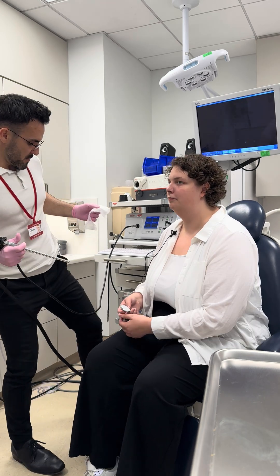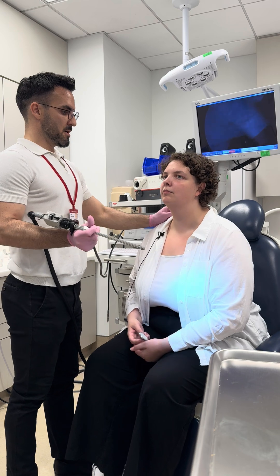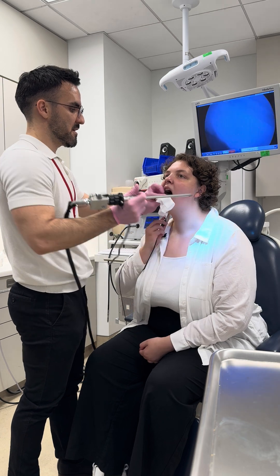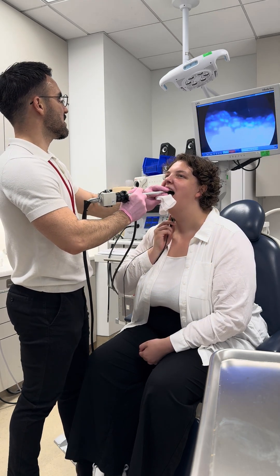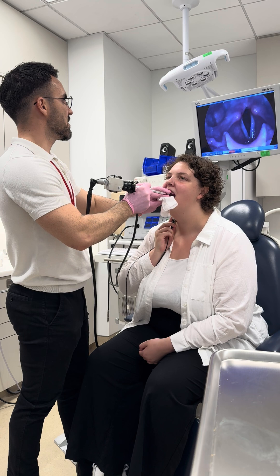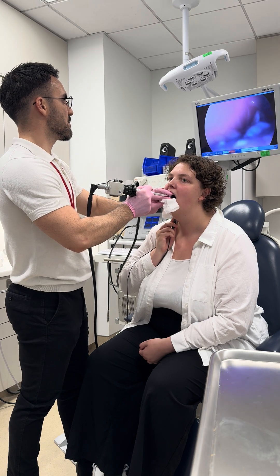All right, right here. Lean forward, straighten your back, shoulders down, chin up, and go ahead and stick out your tongue as far as you can. Good. I'm just gonna keep it nice and soft. Gently bite down, smile and say eeeee.